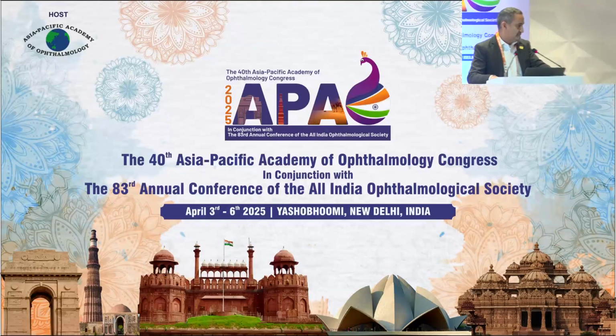Thank you very much, Dr. Tamjid, for a wonderful presentation of post-LASIK cataract surgery, because you have explained each and everything: the IOL formula calculation, the pre-op investigations, and then the surgical procedure in all these cases. The most important thing in post-refractive surgery is to know what refractive surgery was done. If you have a history and a record, then it becomes a little easier. If not, then you have to do a good pre-operative evaluation of the patient, which is very important, in terms of Pentacam, looking at all the parameters of the eye, and then comes the IOL power calculation, which you explained very well along with the surgical procedure. Thank you very much.